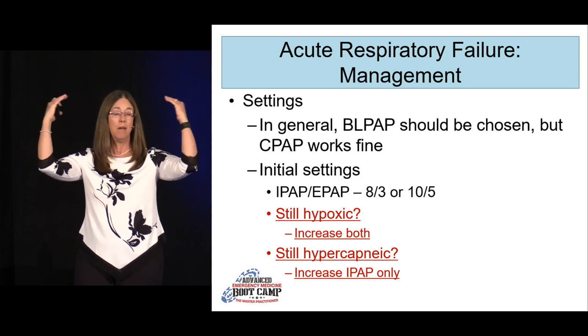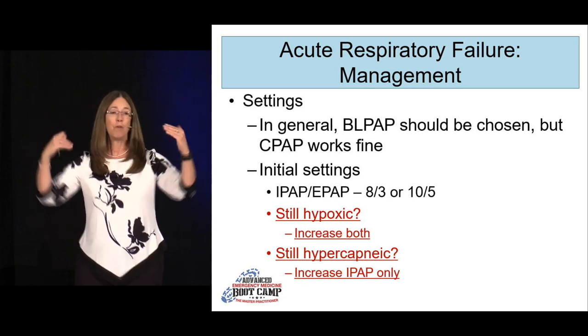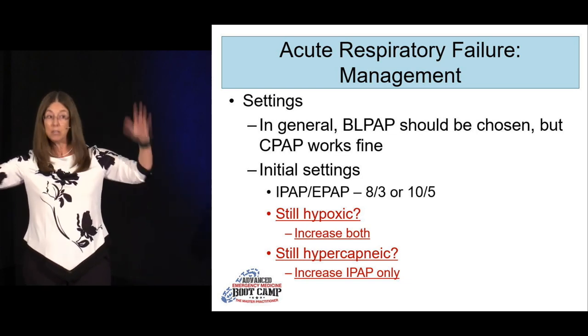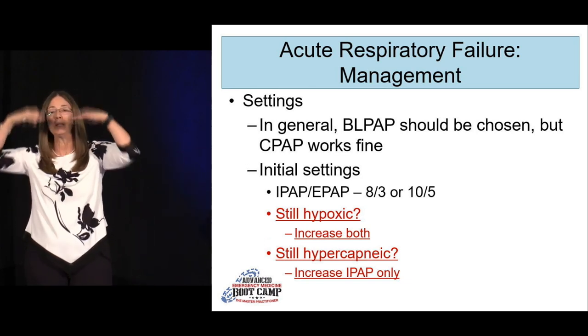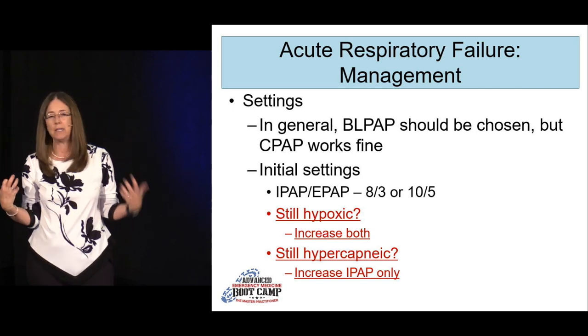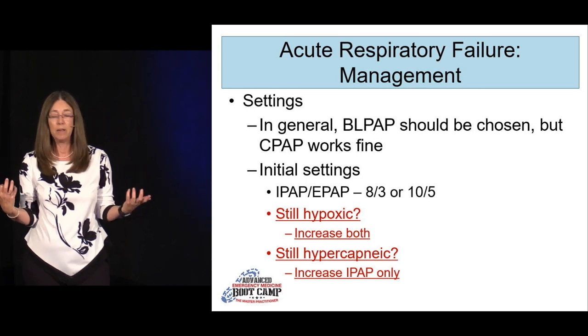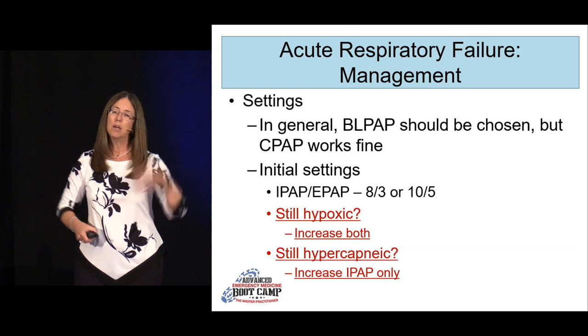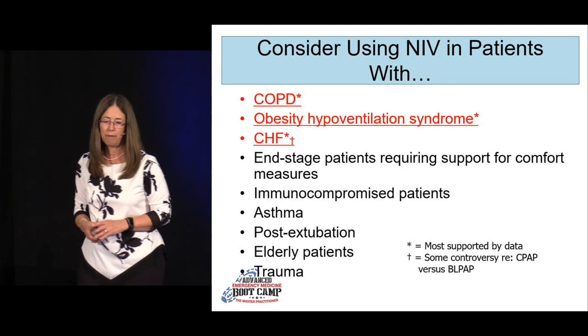You're going to pick numbers like 15 over 10, 18 over 13. You're going to pick big numbers because as long as their blood pressure is fine, which it usually is, it's usually high, they'll be able to handle that pressure in the system, and it's going to shove that fluid back into the interstitium. It's actually pretty effective, and watch them because they get better pretty quickly. But that's the only time you're really, on purpose, going to choose higher numbers: acute decompensated heart failure.